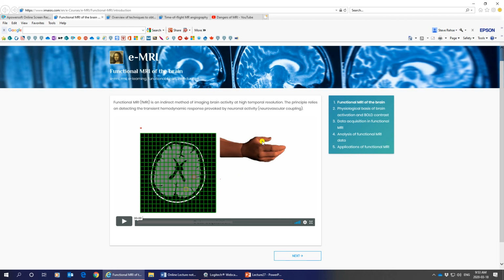So in this simple experiment, we are asking the patient, say they're looking at a light or listening to headphones, to move their thumb in response. Sometimes they wear glasses or headphones. Say you give them a small pair of glasses and tell them, when you see the little red light come on in the corner of your glasses, move your thumb. When it goes off, you stop moving. We're going to need them to do this for several minutes at a time. Watch what happens.